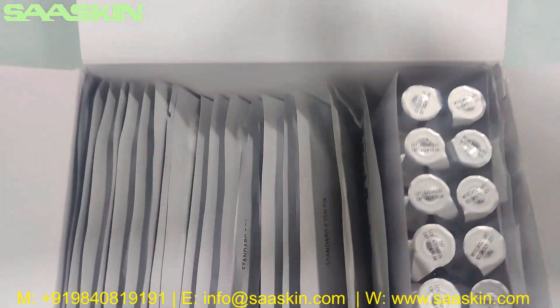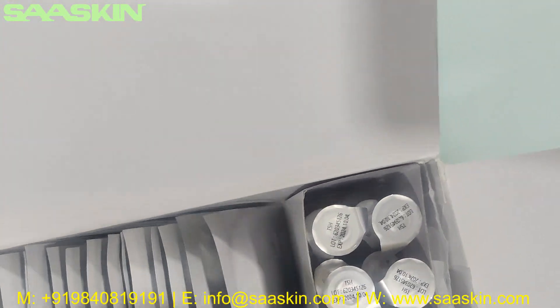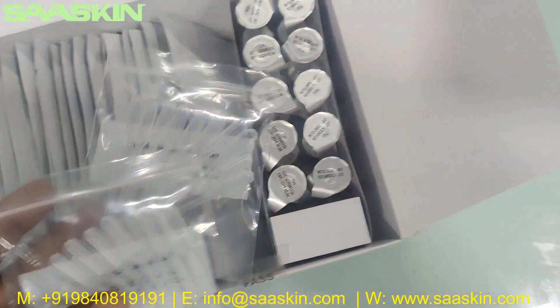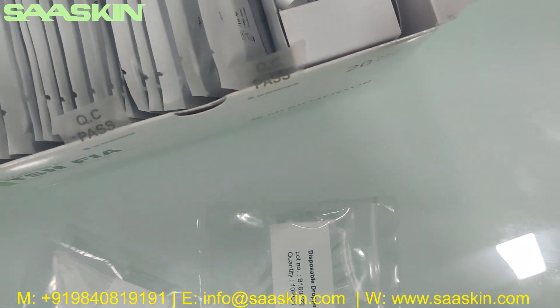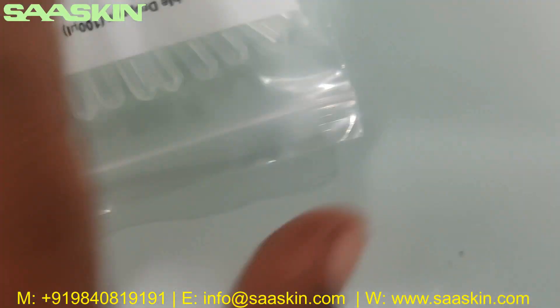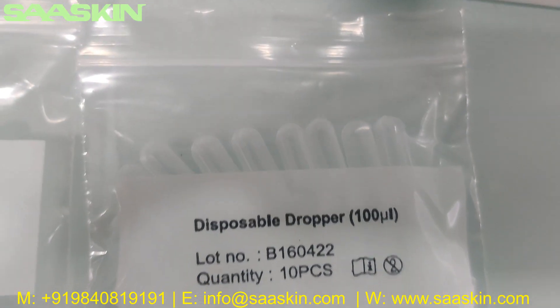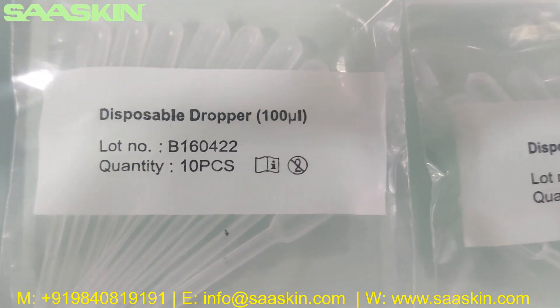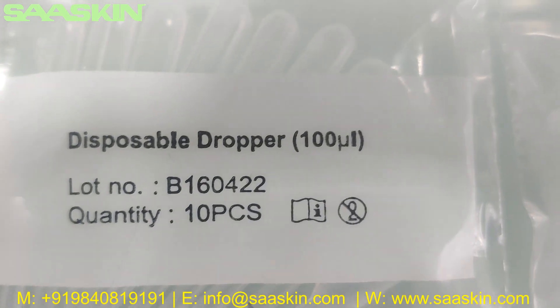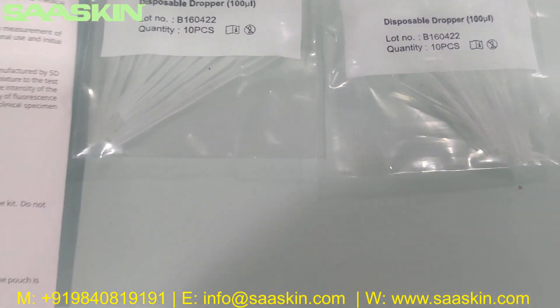Let me get inside. There is a extraction buffer. Each pack contains 10 pieces, with 2 packs of 10 each. Here we go — this is a disposable dropper. There are 2 packs with 10 pieces each.